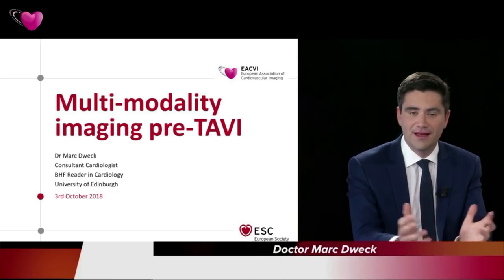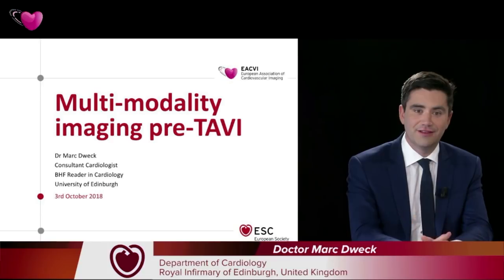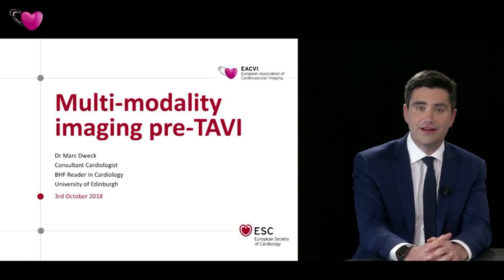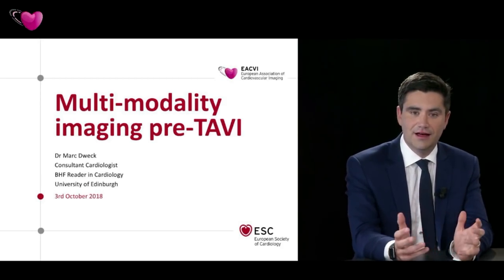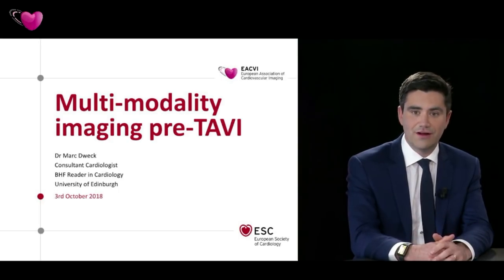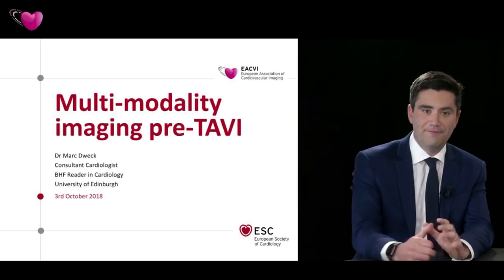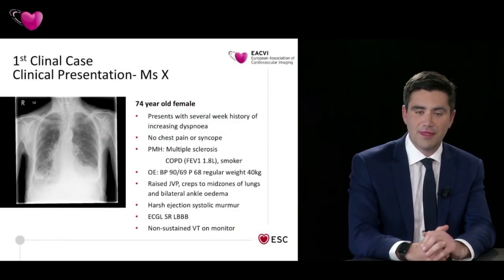So I'm going to kick off with a case, a patient that I looked after and first met a couple of years ago now, actually. But I think it's an interesting case and provides a good illustration of how we can use different imaging techniques to try and assess our patients in the lead up to TAVI or surgical valve replacement. So we'll kick off. And the patient is, we'll call her Miss X.